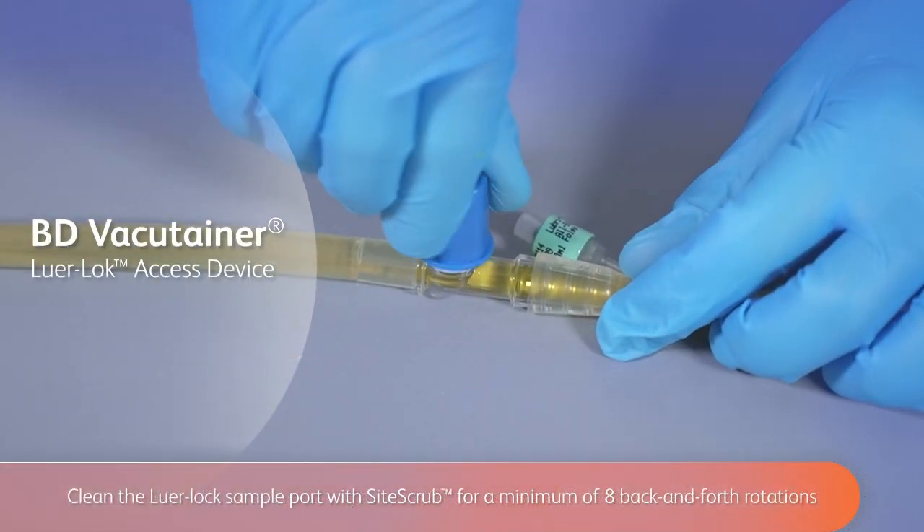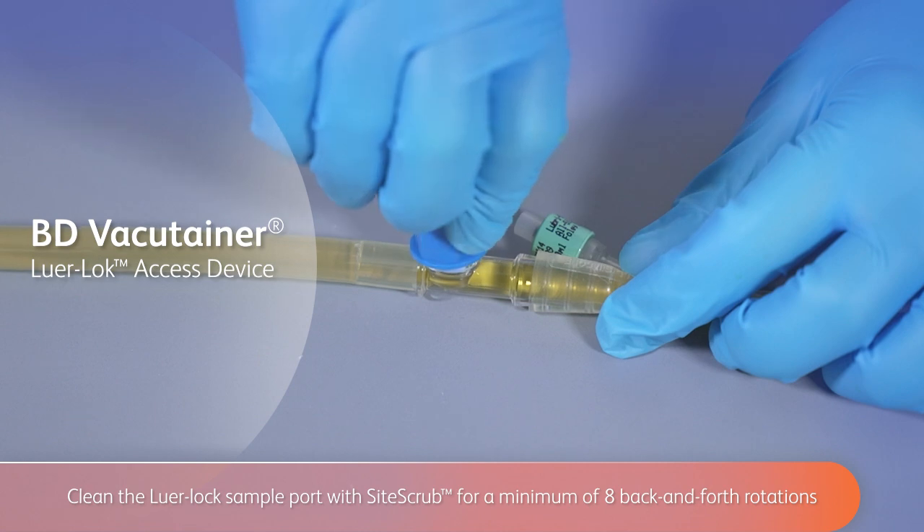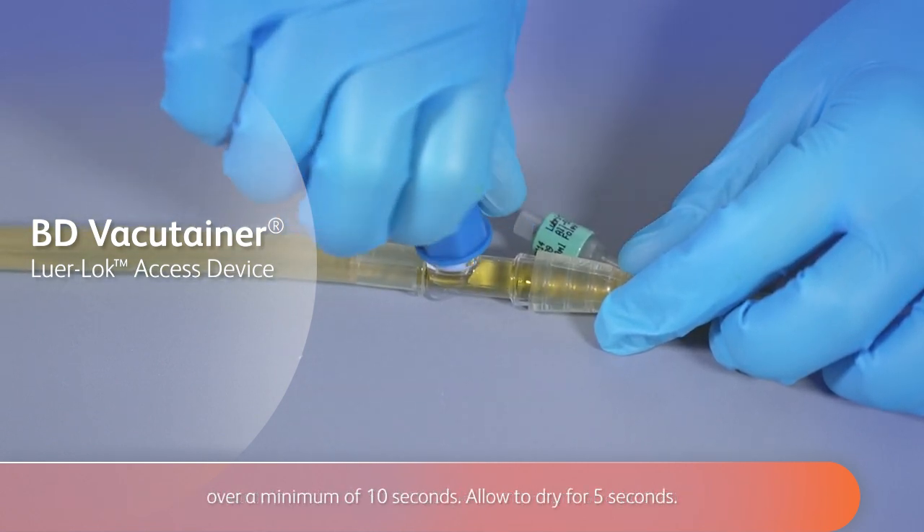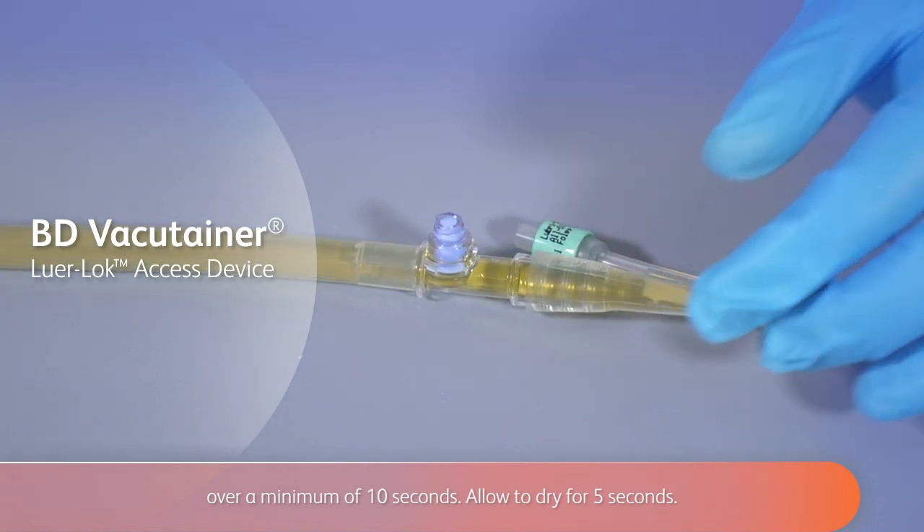Clean the Lure-Lock sample port with site scrub for a minimum of eight back and forth rotations over a minimum of 10 seconds. Allow to dry for five seconds.